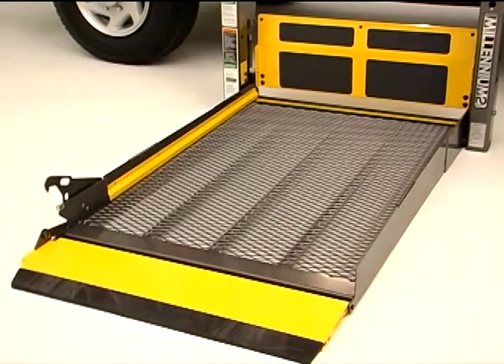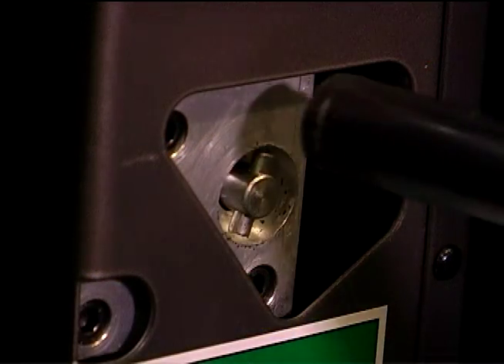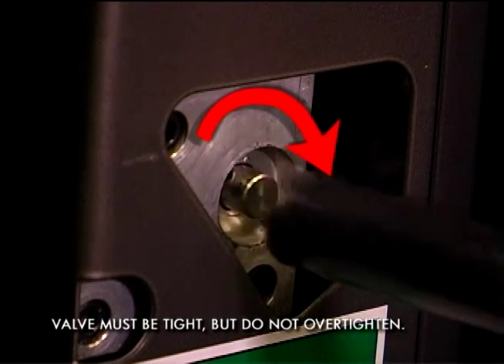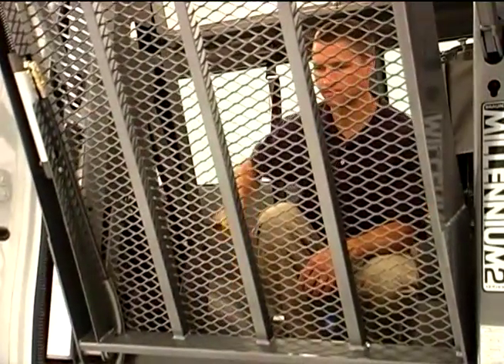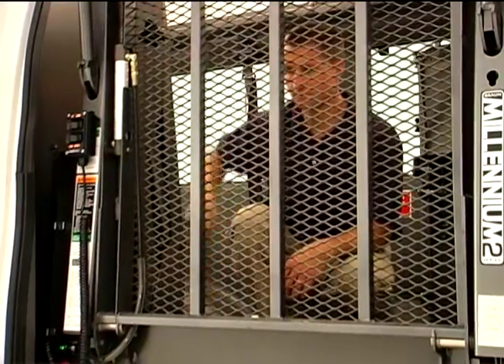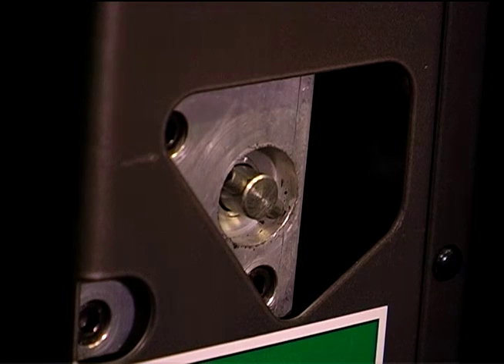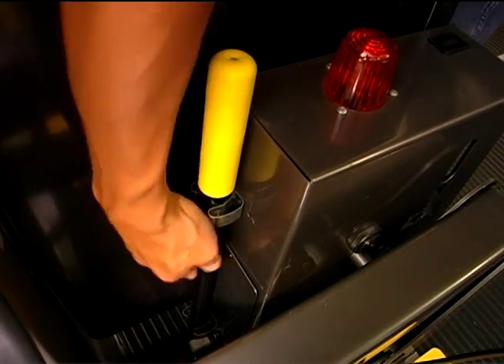To manually raise the platform and return it to its storage position, close the release valve by placing the slotted end of the pump handle onto the backup pump release valve and turning clockwise. Then insert the handle onto the backup pump and stroke until the platform reaches floor level. With no passenger on the platform, you can continue to stroke until the platform folds fully. Be sure that the release valve remains closed and ready for automatic operation once power is restored, and be sure to return the pump handle to its storage clips.